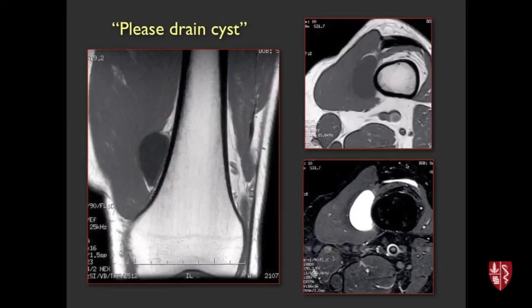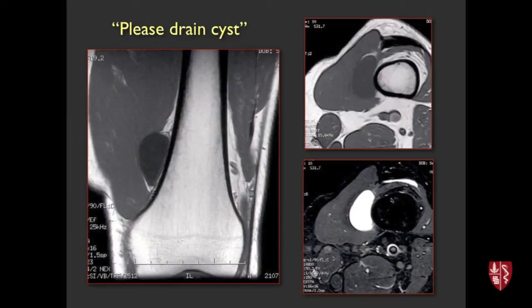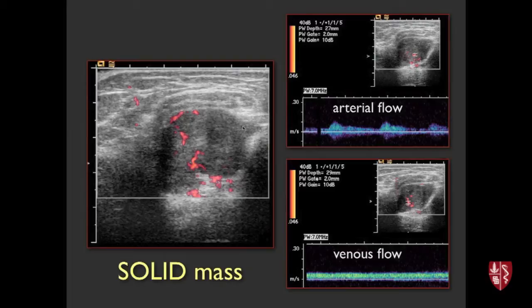Here's an example that came in a number of years ago showing a lesion adjacent to the distal femur — quite hypointense on T1-weighted MRI and pretty similar in intensity to the joint recess on T2. It's an unusual location for a cystic lesion. The surgeon said he tried to drain it in the office and got some fluid out but couldn't completely drain it. So he sent it to us. The first part of the process is to put the ultrasound probe on the lesion and assess it. You can see with color Doppler that this has internal vascularity — it's a solid lesion with arterial and venous flow. This is a lesion where we back up and say we can't drain this; it's not a cyst and needs to be seen by orthopedic oncology. I went ahead and did a biopsy in collaboration with the orthopedic oncologist, and it turned out to be a myxoid liposarcoma.